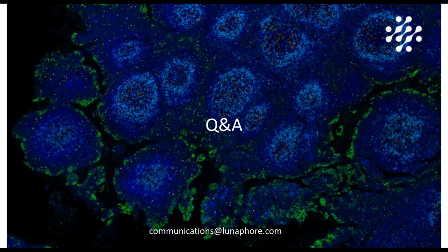But in general, I would say that LabSat Research is more suited for projects where it's not necessary to run 30 slides at a time, but rather to obtain results fast, and also if you're looking for high staining homogeneity on samples where it is difficult to achieve.